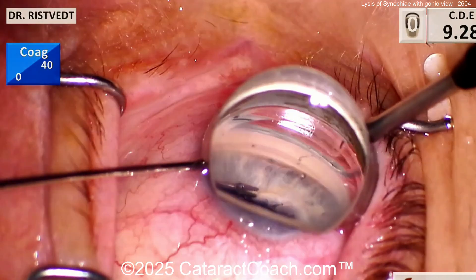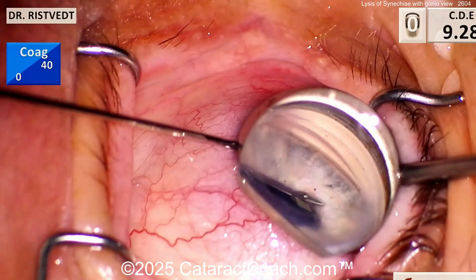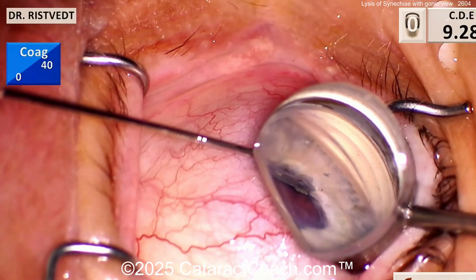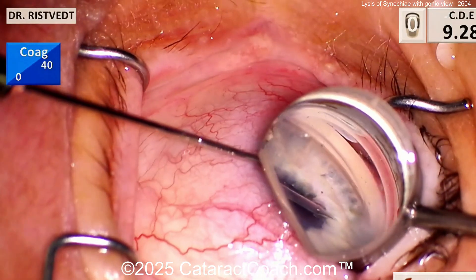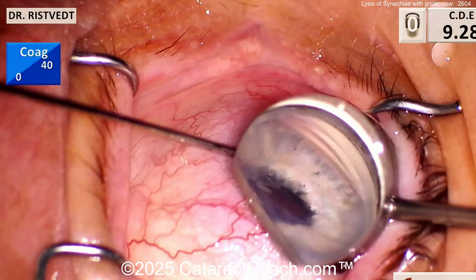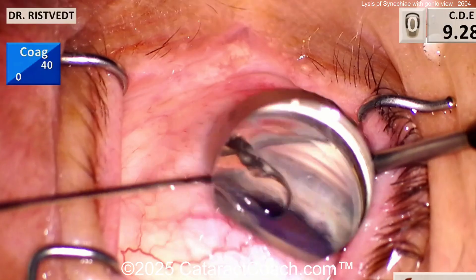Look at that - as the iris is grabbed, you can see you're able to break those peripheral synechiae and open up the angle. Going around 360 degrees, grabbing the iris very gently, pulling, pulling, pulling. I often do this intraoperatively as well. You don't necessarily need to use the gonio prism - you can actually just look at the eye directly and use your capsulorrhexis forceps or other micro forceps to grab the iris and pull it centrally very gently in order to break those peripheral anterior synechiae.